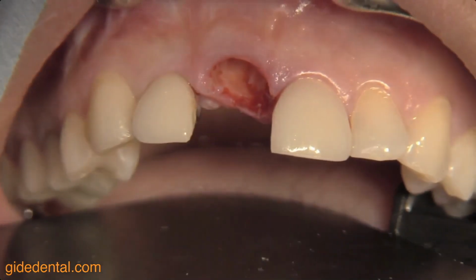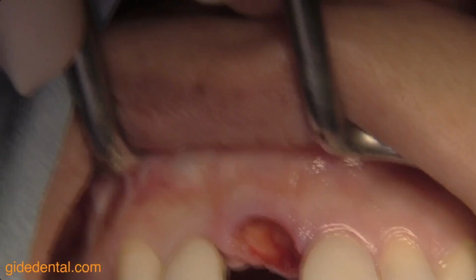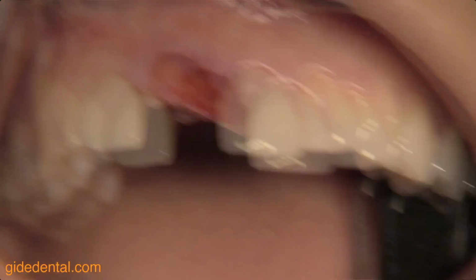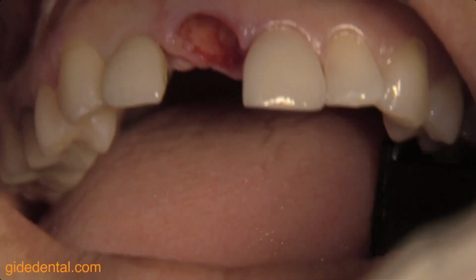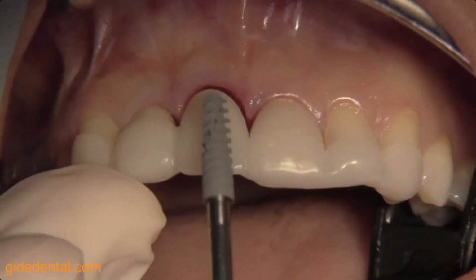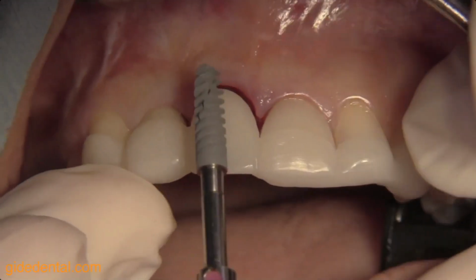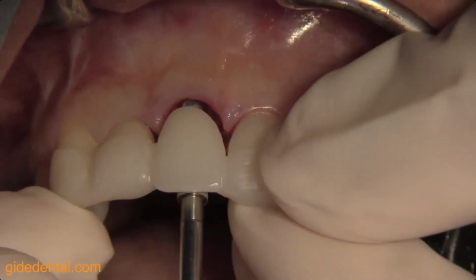Here we can go and evaluate the site. And checking this. And here comes the implant. So that's my 3.5 millimeter diameter, Noble Active, narrow platform by 13.